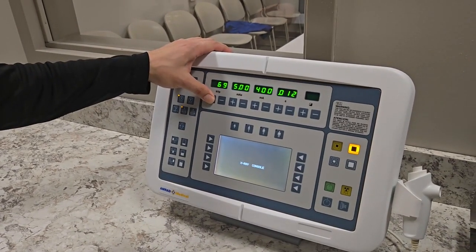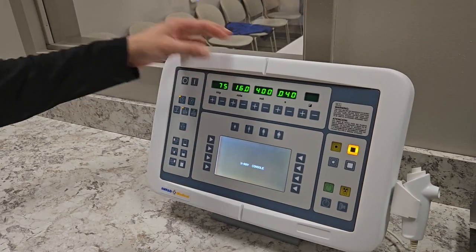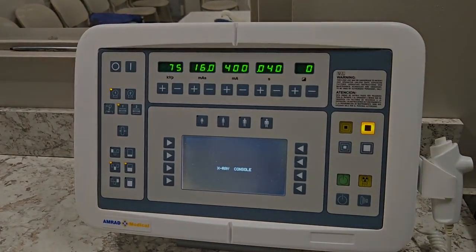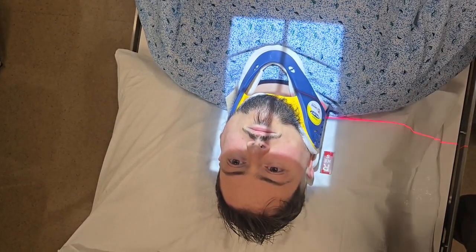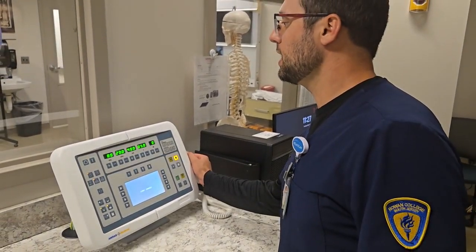Apply a technique of approximately 65 to 75 kVp and appropriate mAs via AEC for adequate penetration. If setting manually, 8 to 12 mAs is normally used. A grid is typically used due to body part thickness, but in instances of severe trauma, we can use a tabletop or portable image receptor. Place the anatomical marker on the side of interest, clear of anatomy, instruct the patient to hold still, and suspend breathing during exposure.